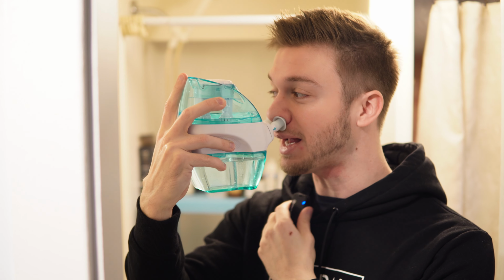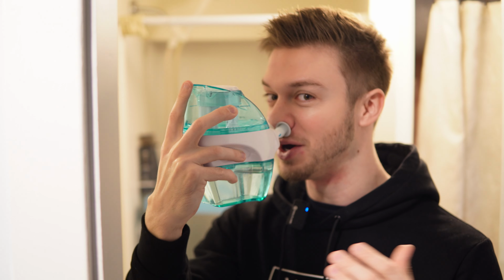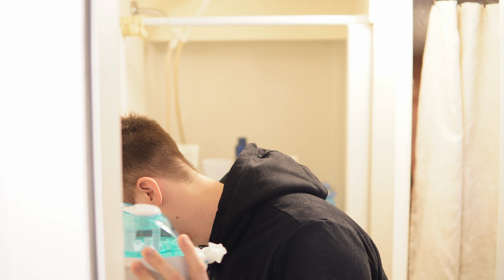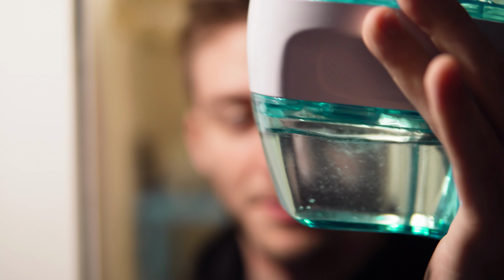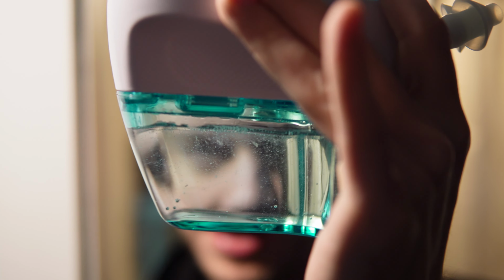You may have some water come out afterwards, just like that. That's okay. It's kind of like going swimming in the pool. But you'll see there's a lot of dust and stuff up there that I was able to get out. Feels a whole lot better already.